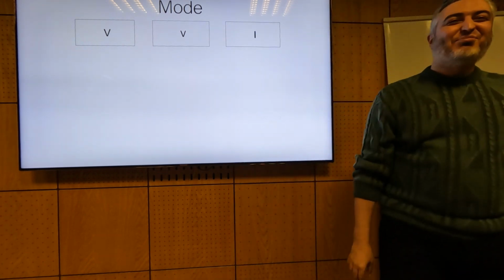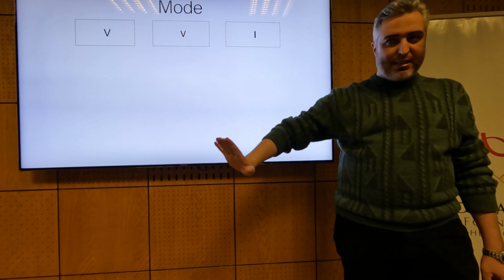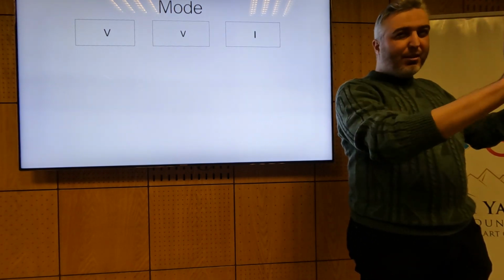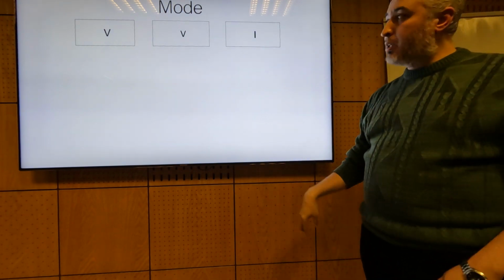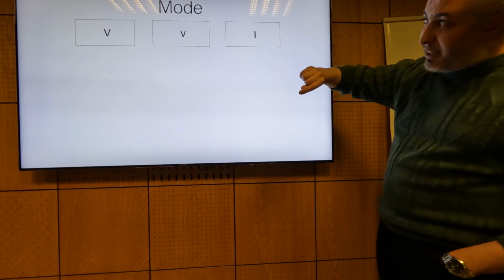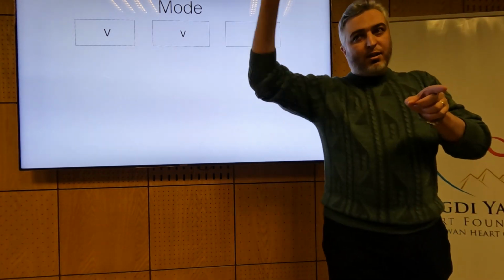Okay, now we go to the ventricle. So now we've discussed atrial pacing: AAI, atrial pacing, atrial sensing, where sensing inhibits atrial pacing; and AOO, which is fixed atrial pacing without sensing. Now we move to the ventricle, VVI. What are we pacing? Ventricle. What are we sensing? Ventricle. What's the response of ventricular sensing on the ventricular pacing? So sensing ventricular activity inhibits ventricular pacing.